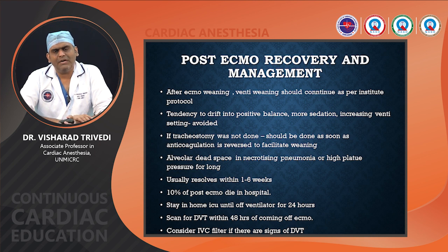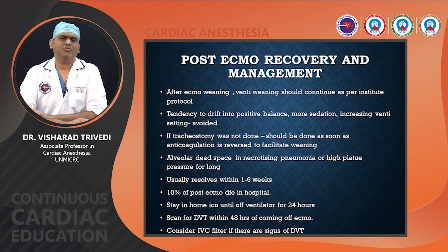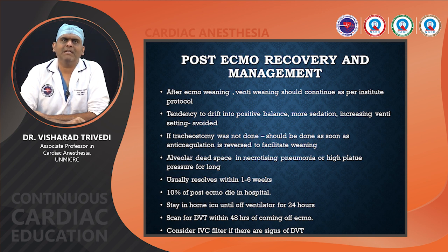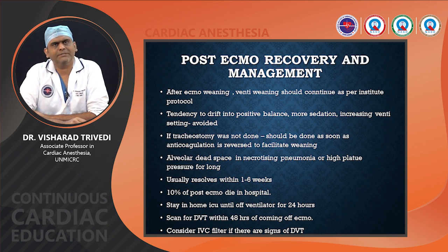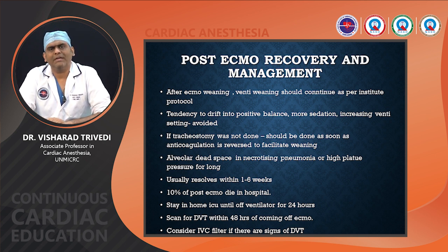Now after ECMO removal, you also have to maintain the ventilatory management as well as gaseous exchange through the native ICU period, because if there is a recurrent infection or recurrent respiratory dysfunction, then you will again land up in complications. So after ECMO weaning, ventilatory settings should be continued as per the institute protocol, mostly lung protective strategies. Tendency to drift towards positive balance, more sedation, and increasing ventilatory settings should be avoided.